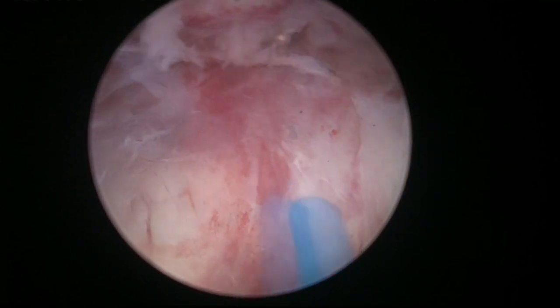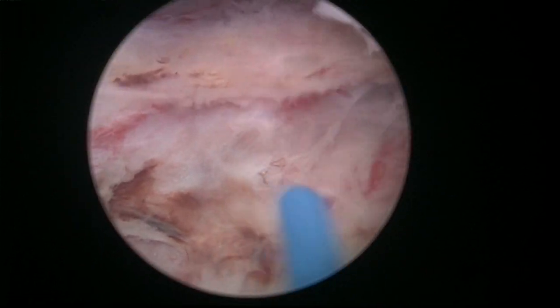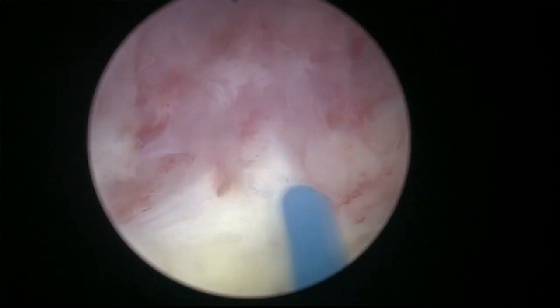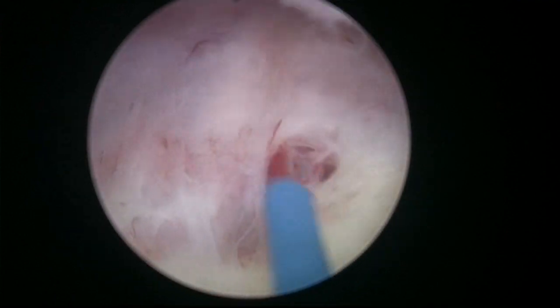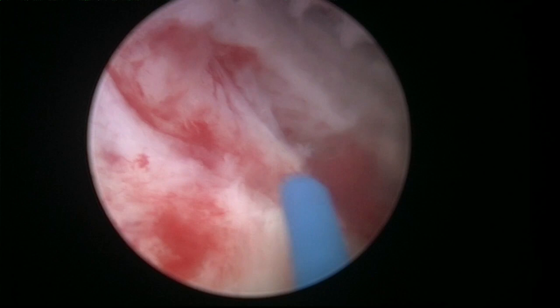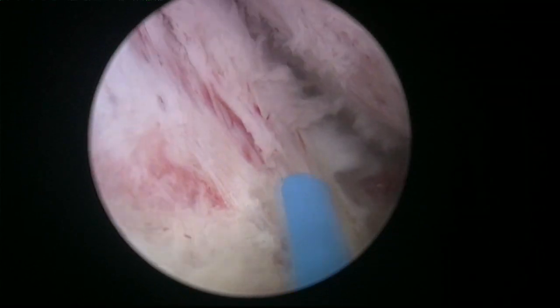But this is more bloody than usual, this patient. I don't know why. We've done other cases and we didn't see this kind of hypervascularity. This is starting to look better and better.